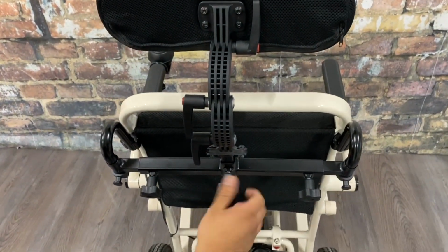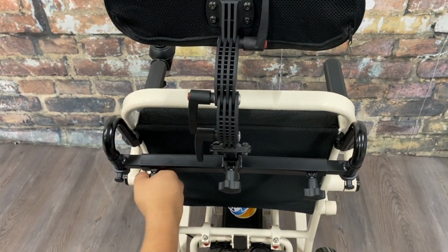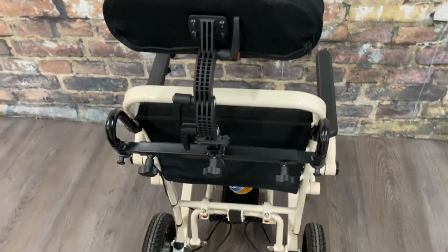Now make sure all the bolts are tight, all the levers are tight, so your headrest is secured to your MagSHOCK. That's it.